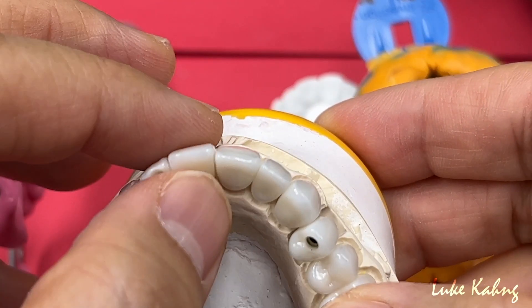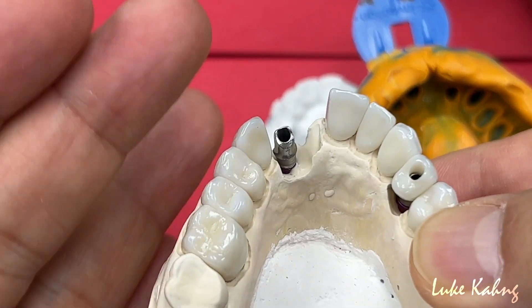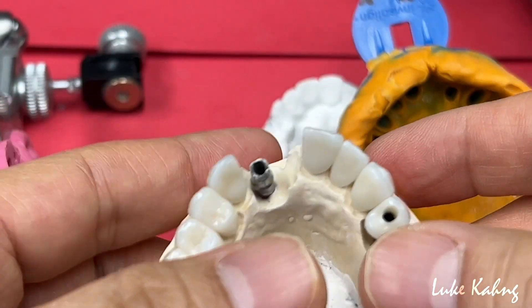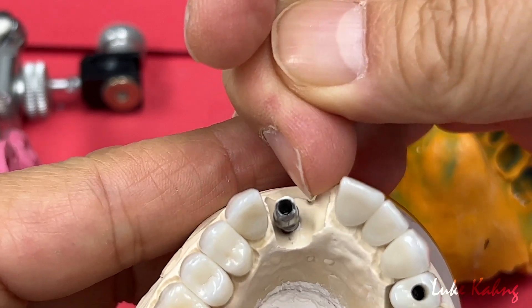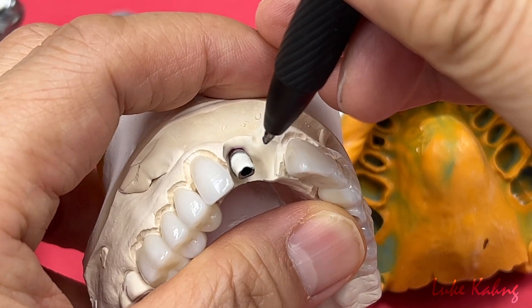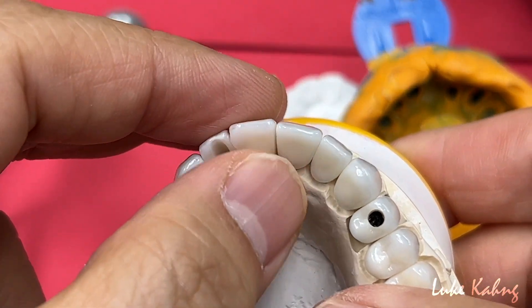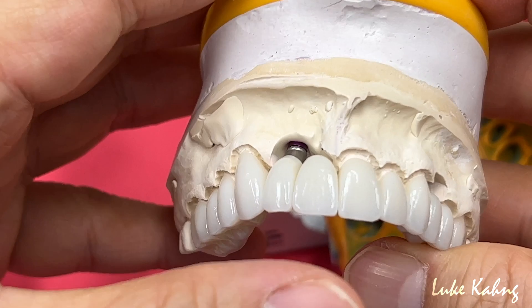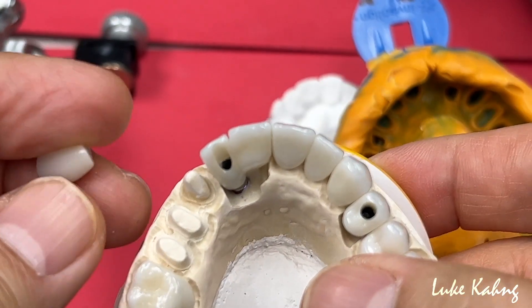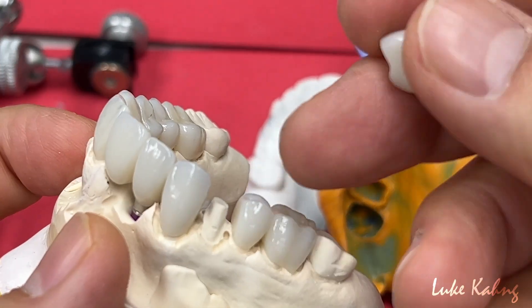My job is trying to bring in the implant angulation toward lingual. Unfortunately a little bit small, which is the custom abutment. I trimmed with tissue here — that's my previous one. So doctor Boyer have to get on the same page, but I did, because I have to make this better — the same tissue contour, which is very imperative. We made it perfectly.